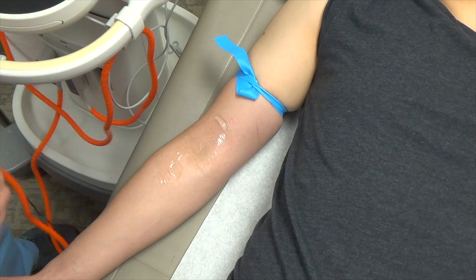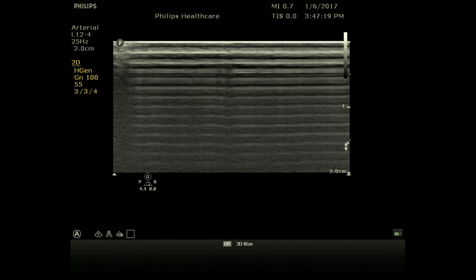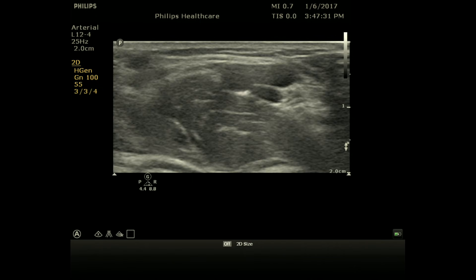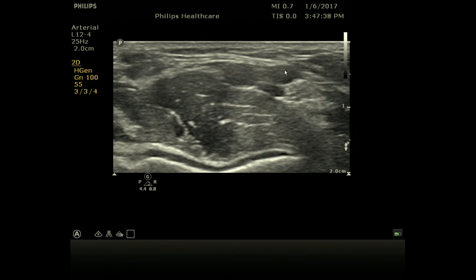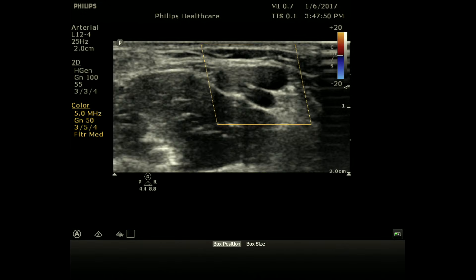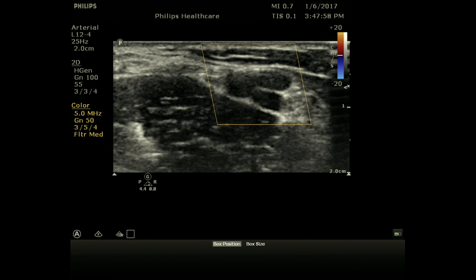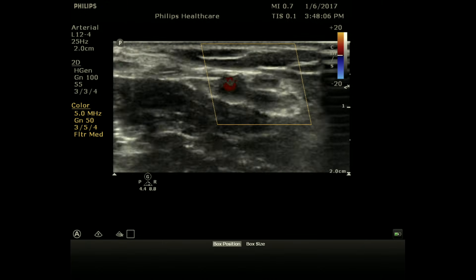Now use the ultrasound to scan for the vessel. Use a vascular setting — arterial, venous, or vascular all work. Place the probe with the indicator towards your left over the antecubital fossa. Here you can see the artery pulsating, and the vein right next to it. Scroll up and down to find the best spot to cannulate. You can use color doppler — the artery is clearly pulsating, while the vein has such low flow that color doppler won't show it. You can also compress to confirm: the artery pulsates and the adjacent vein does not.